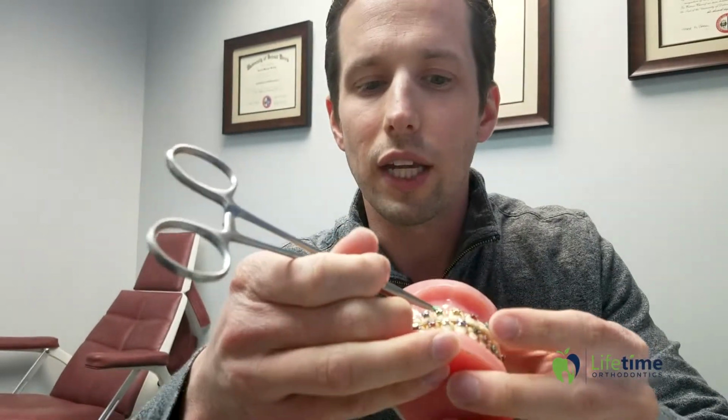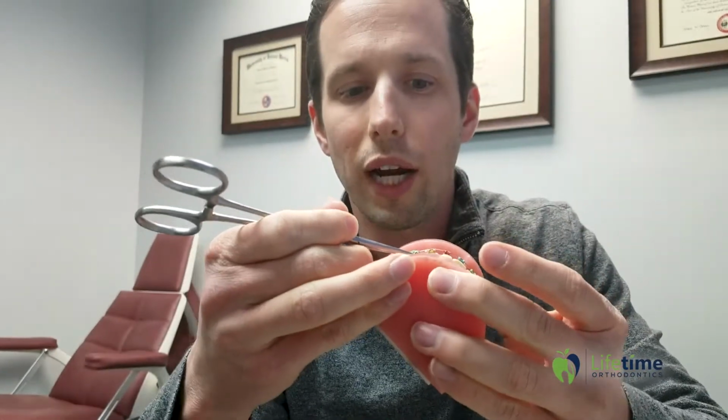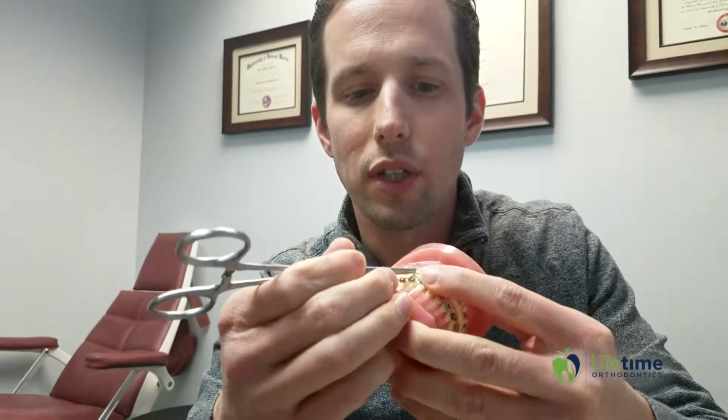You kind of just lay it over the hook or one of the brackets, and then you wrap it around until you get it on there, right? Okay. It's probably rare that you're going to have to use this, but it's in there just in case. You can also use this to redirect a wire if you can see it's clearly sticking into the gum tissue or something like that.